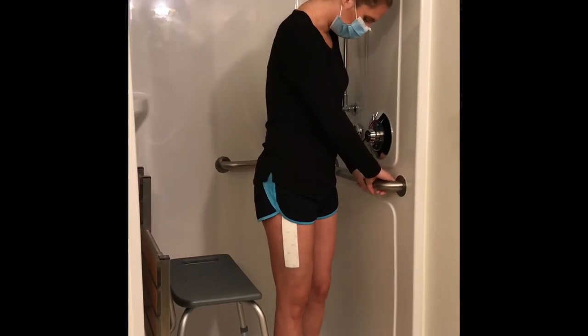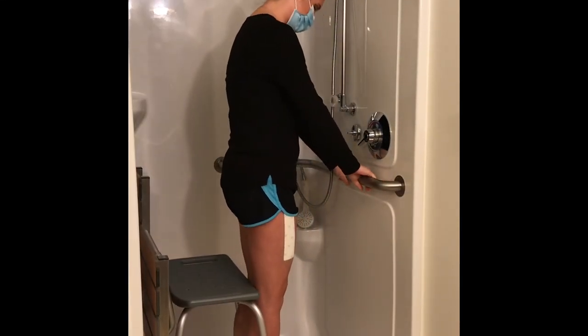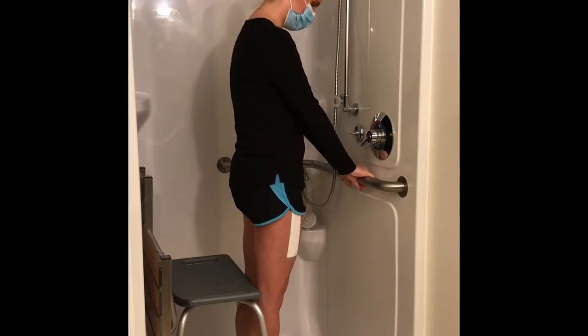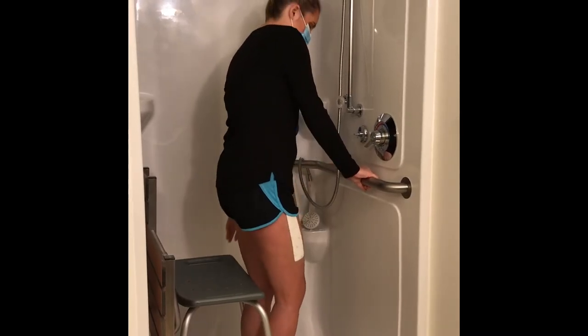Turn slowly in front of your shower chair so you can feel the chair on the back of your legs. Use grab bars while doing this for safety. Reach your hands back for the chair and slowly lower yourself into sitting.